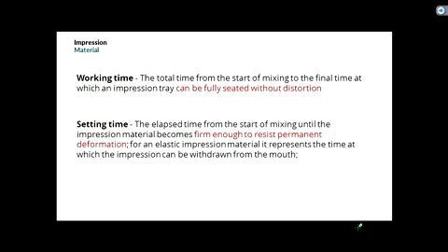So as you make your impressions in Sim Clinic, also in the clinic downstairs, one of the skill sets you'll need to develop is, you're essentially the quarterback of this whole operation. Right? You've got an assistant or a classmate that's helping you load the tray. You've got to figure out how quickly you can inject onto the teeth, and how strong their forearm muscles are and how fast they can pump that gun, because you want to time it so that the minute you're done, the tray is ready to seat.